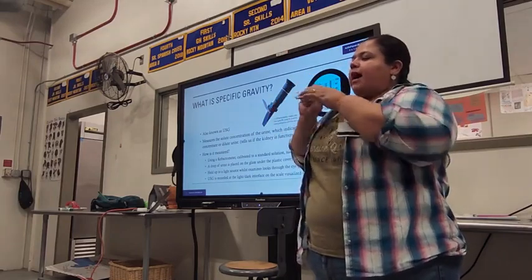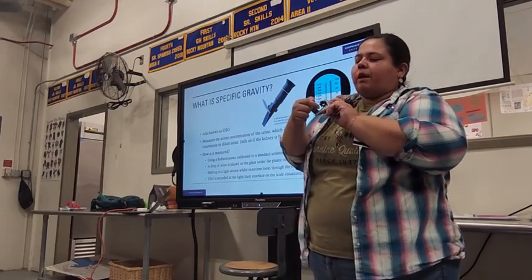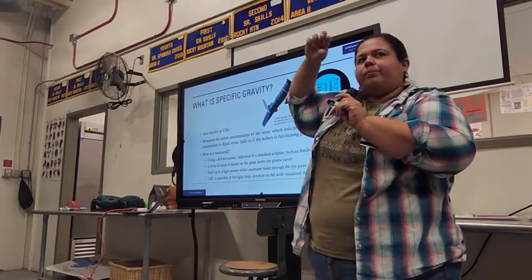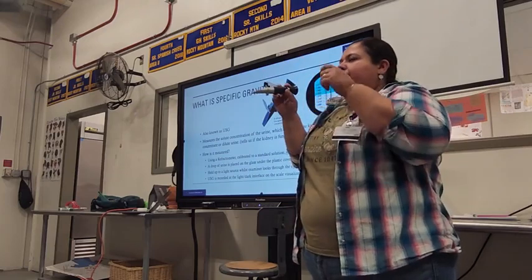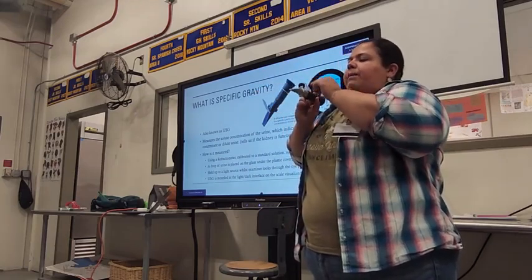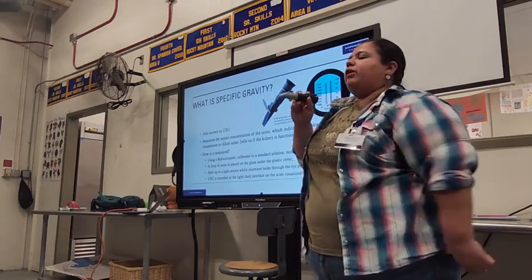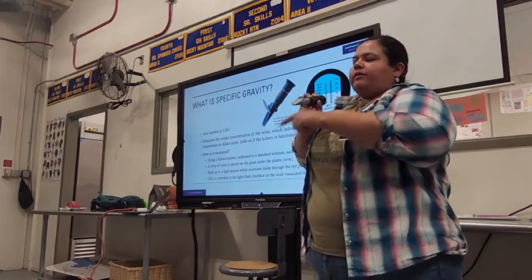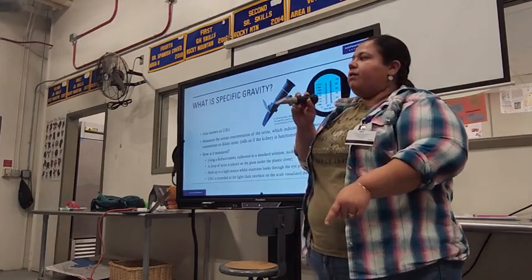This one doesn't have a little circle, but generally speaking, some refractometers have a little circle, like a little divot, where you put it. But if not, you're just going to put it on the glass panel, this blue panel. You're going to close your cover, and it's going to spread out the entire sample of urine that you have on there.